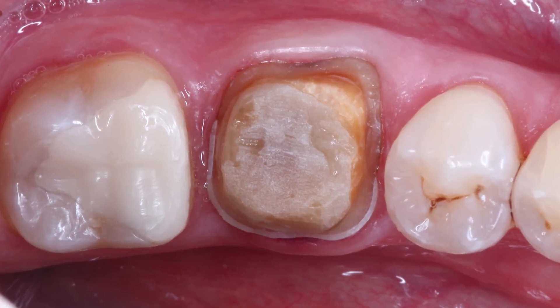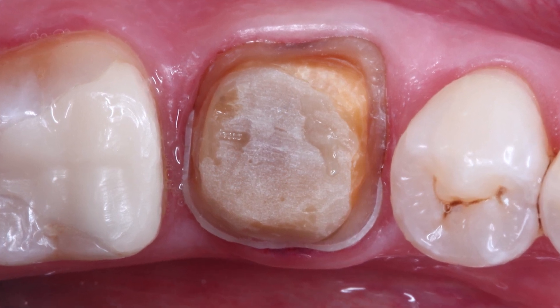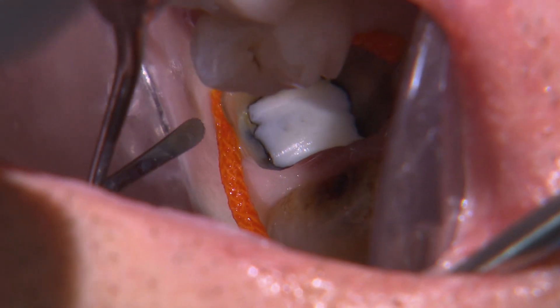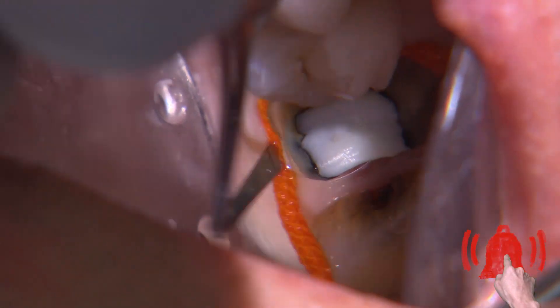To complete the prep, I ensure the axial walls have adequate taper and the internal angles are rounded. I also place a size 2 cord for gingival retraction since the margins are all equigingival.